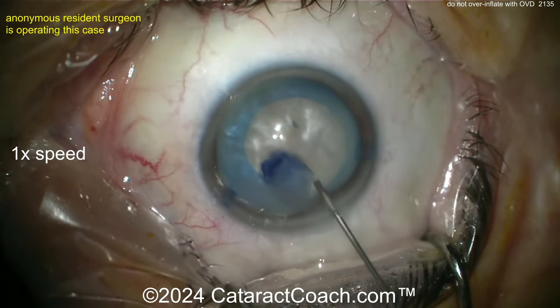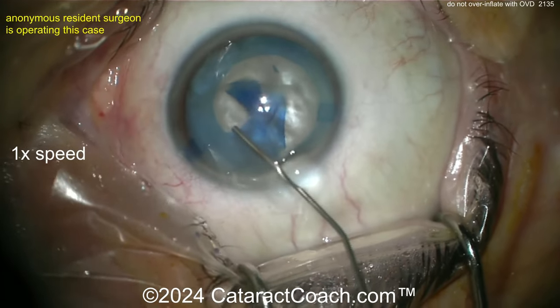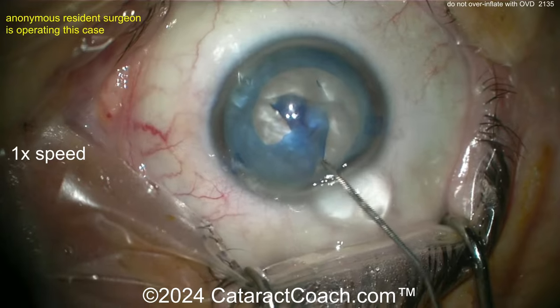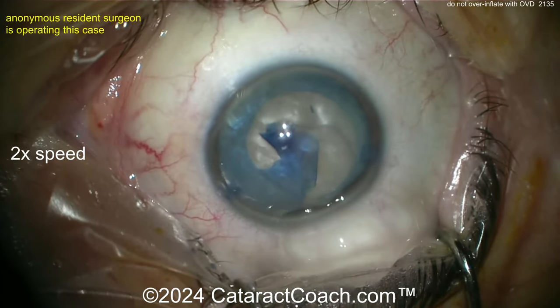Here's the mistake. Put in a little viscoelastic — that's enough, stop. But if you keep going and inject more, you're going to put pressure on that lens capsule and you're going to cause it to zip right out just like that.